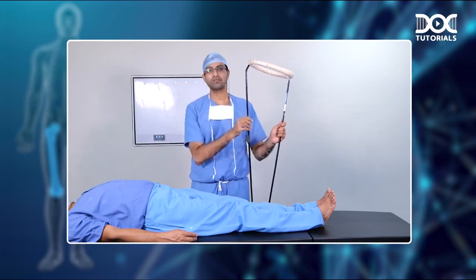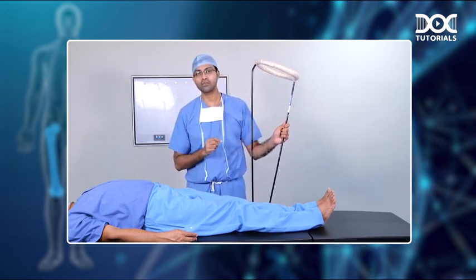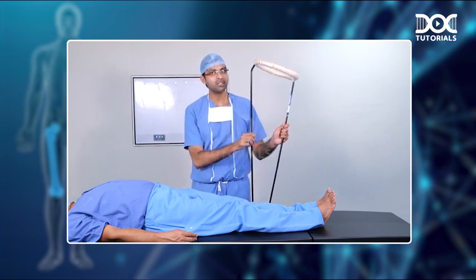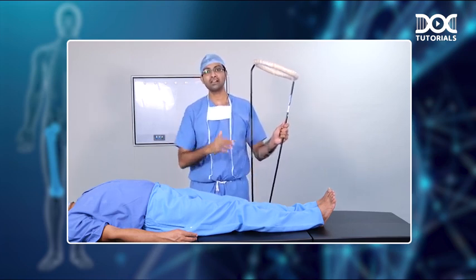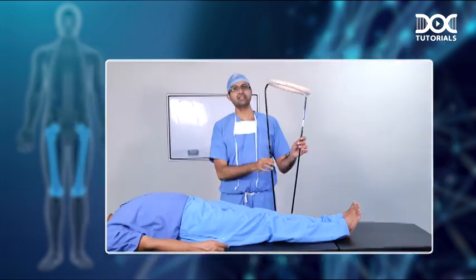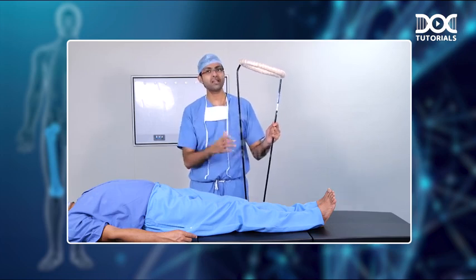See, before the use of Thomas splint, the survival rate for a patient with fractured shaft of femur was around 20%. But after we started using Thomas splint, the survival rate increased to 80%. 4 times improvement in survival. That is the greatness of Thomas splint, and Thomas splint has saved millions of lives during the last 1.5 centuries.